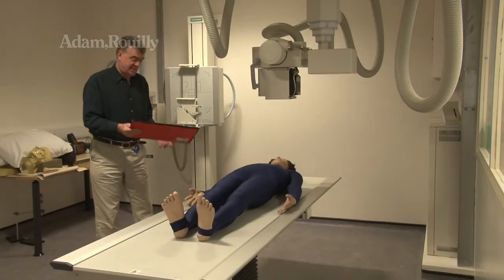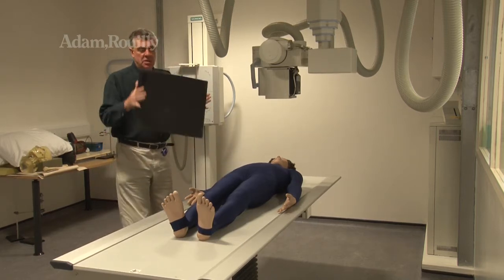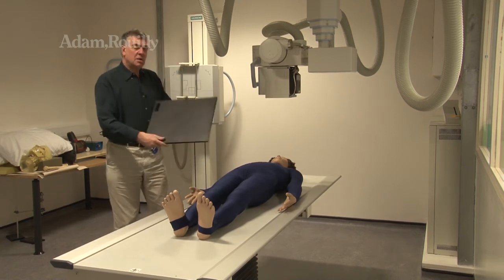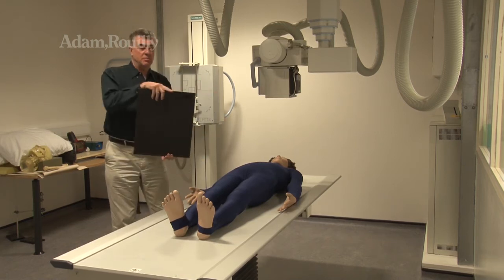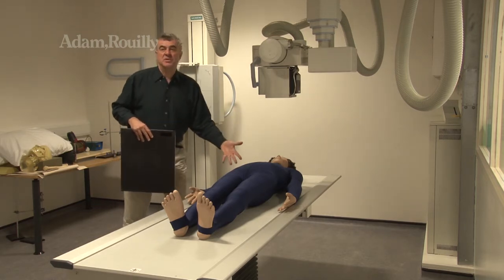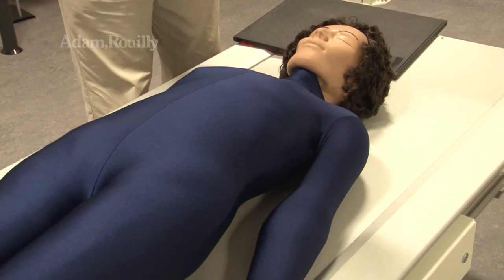And we'll do a chest. Again, a view from the front. This time, of course, I'm going to use a larger plate because the chest is bigger than the head. And of course, I'm going to put it in a landscape position rather than portrait because I want to get the full width and also include the upper arms here. So we do get the upper arms, but we don't need to worry, as I said earlier, about the elbow and the wrists.